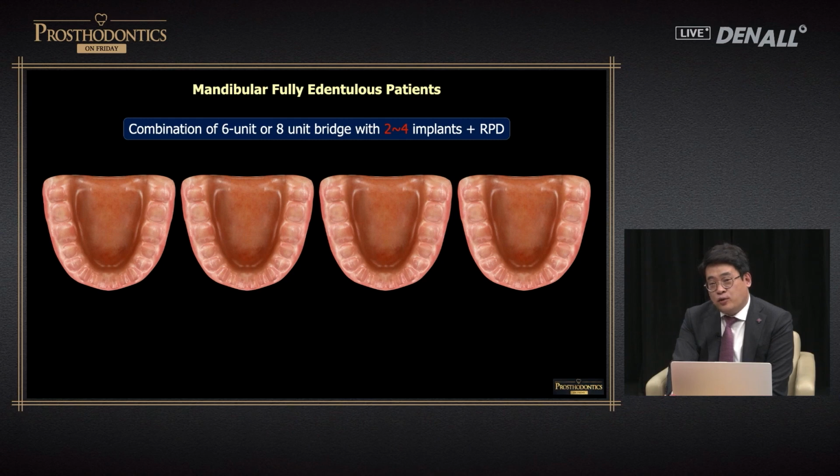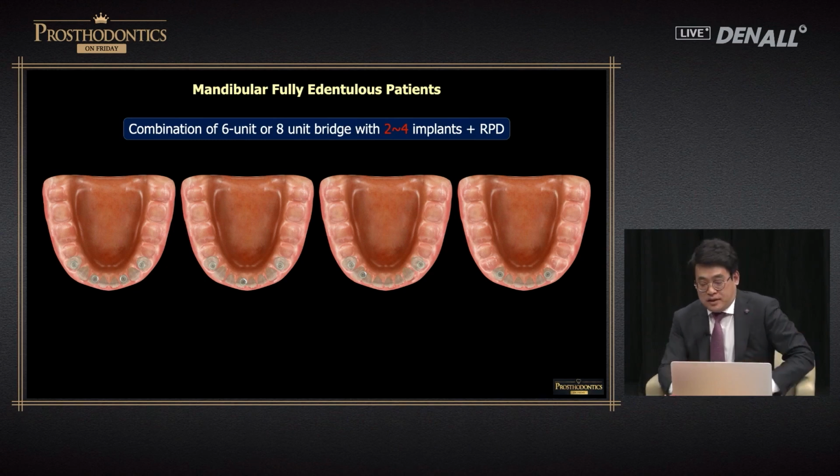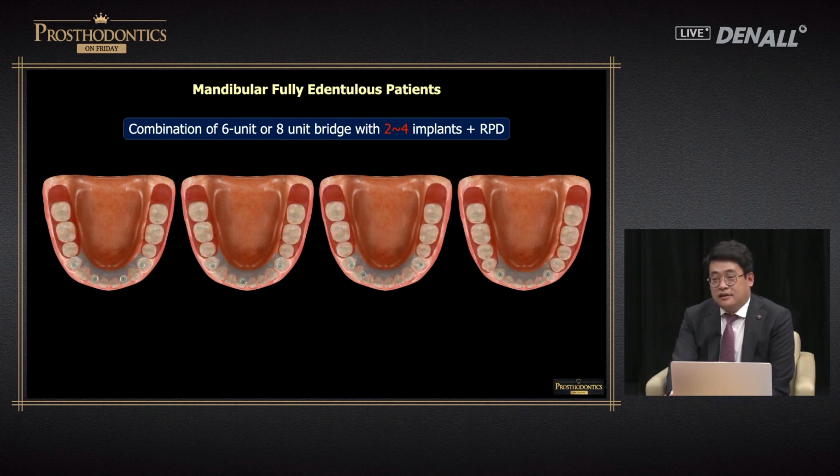In doing fixed prosthesis for the lower, and before we go into it, we can provide this kind of design using a few implants to provide fixed prosthesis in the anterior with surveyed crowns, and in the posterior, you can provide RPD. I've talked about multiple treatment options.